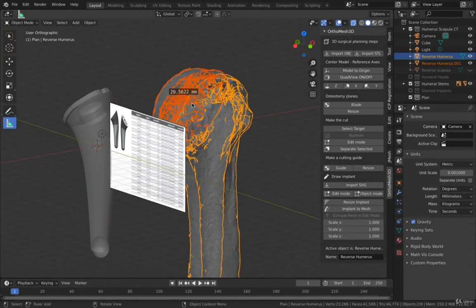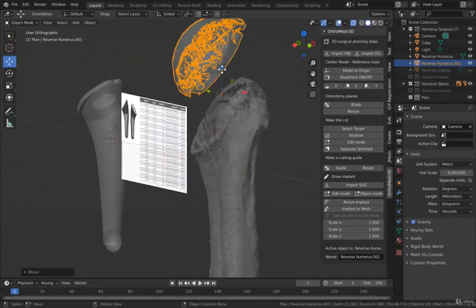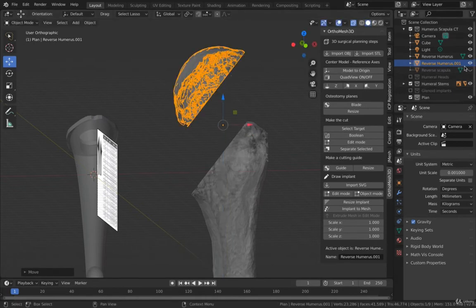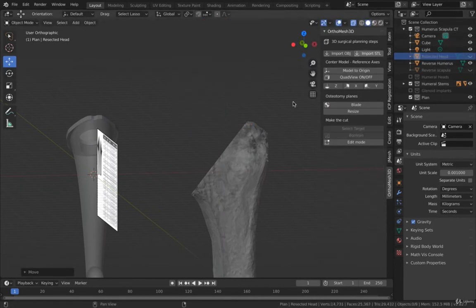And if I go here, I can just take that off. So this is my resected head, and I can just make it invisible. We can just name it resected head, and I will make it invisible for now.